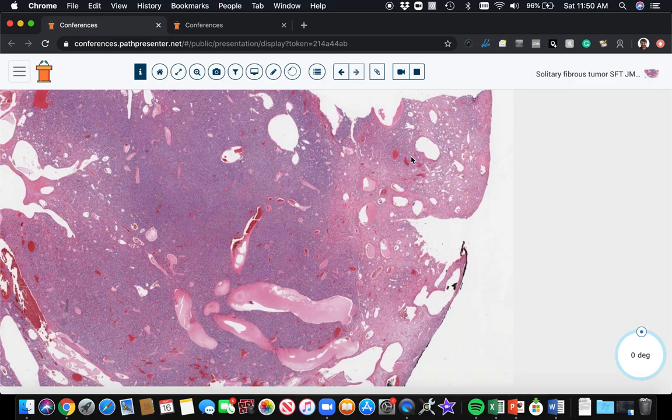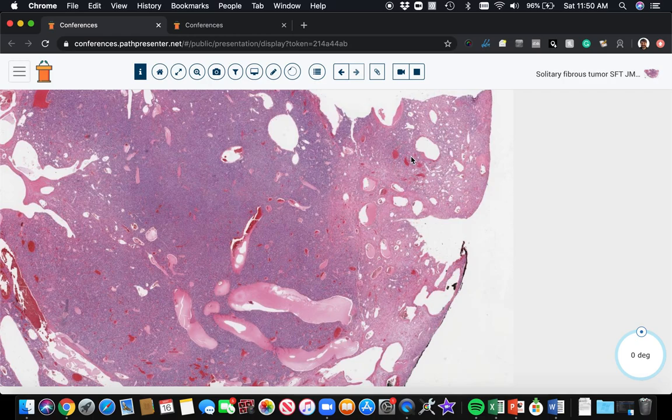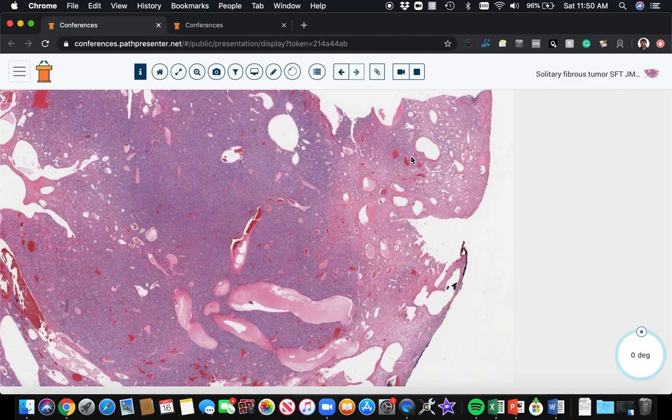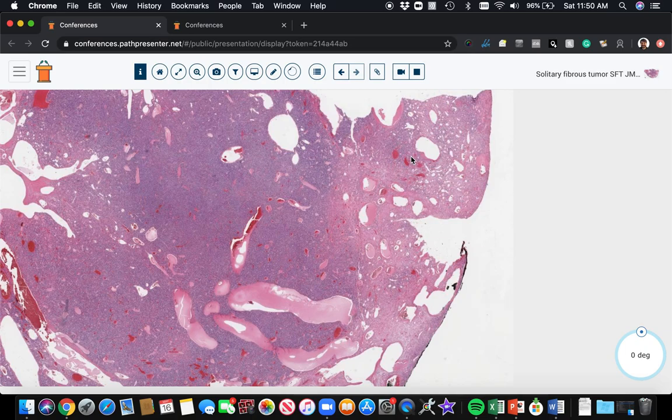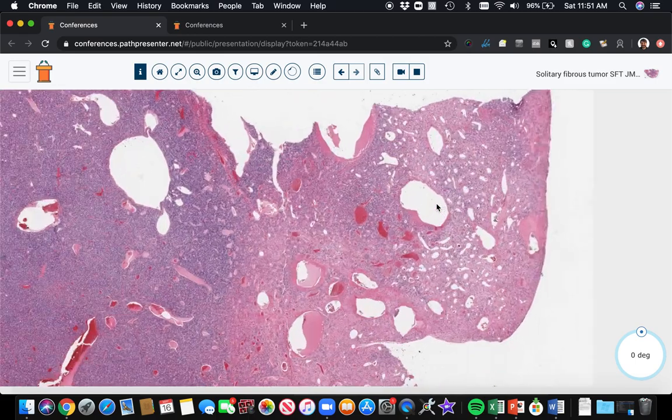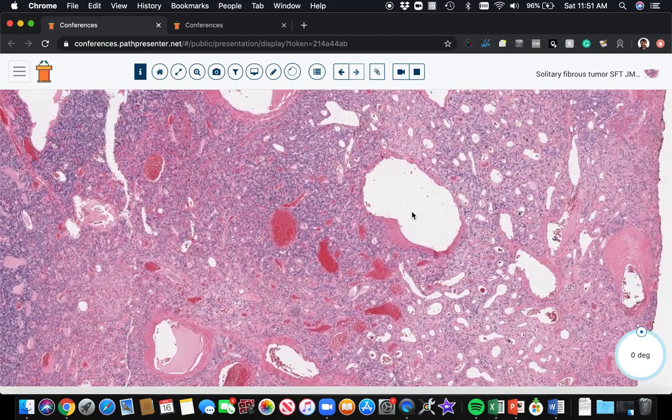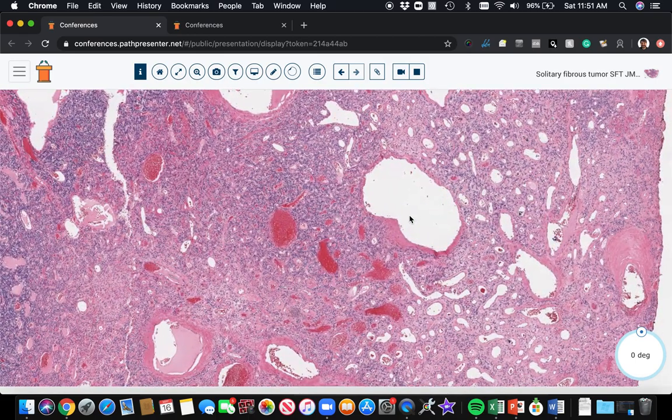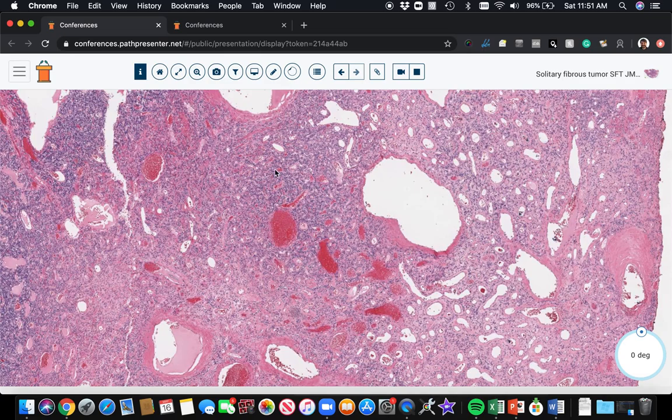Oh, and I meant to point out at the beginning, hemangiopericytoma, I believe, is still used in the central nervous system. I leave that to the neuropathologist to comment on. But elsewhere in the soft tissue outside of the CNS, we don't really use the term hemangiopericytoma anymore. There is one tumor in the nose called a glomangiopericytoma or a sinonasal hemangiopericytoma-like tumor.